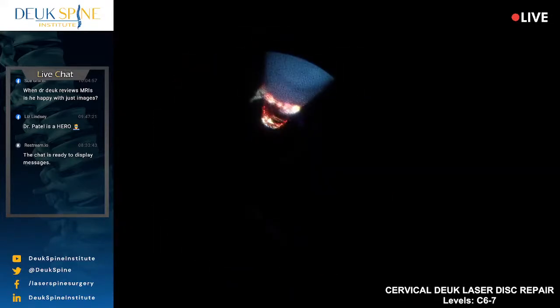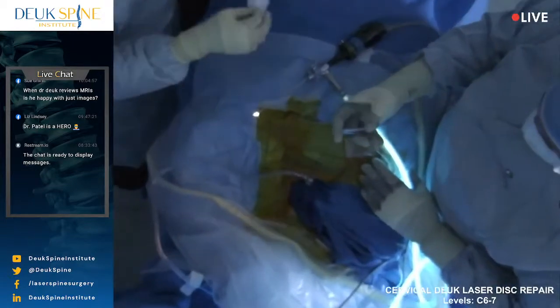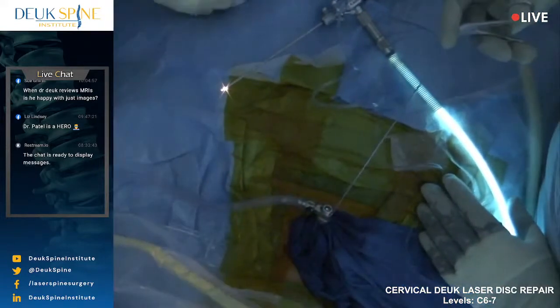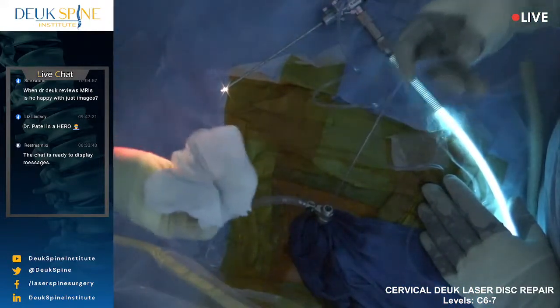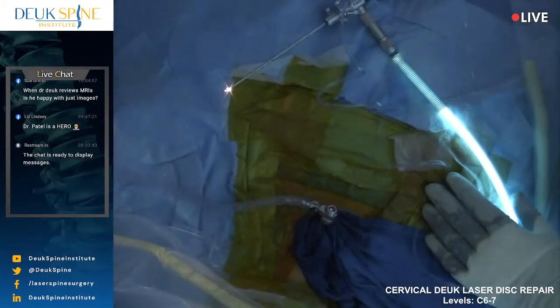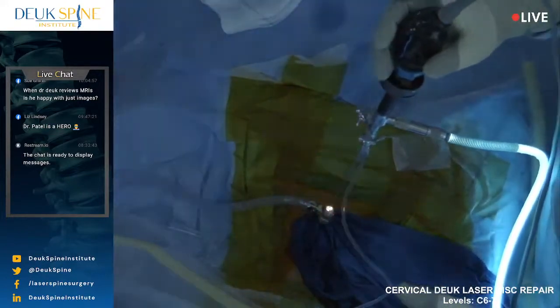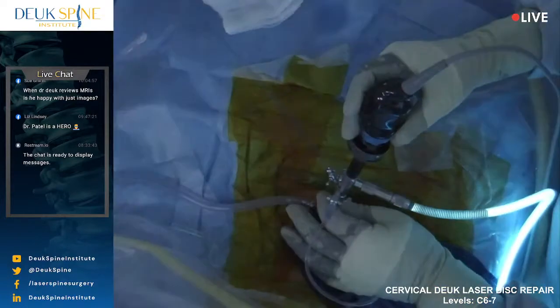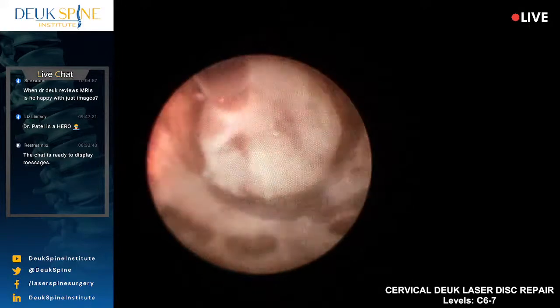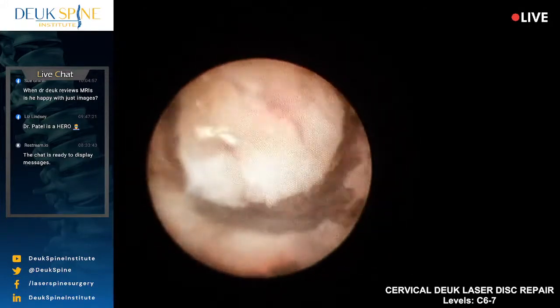Now remember, we don't have the blue stain today. Because I couldn't put the needle in first and then do the discogram, we don't have our blue dye. All right, get the irrigation on. So we can still do the surgery without doing the discogram, but this is all fragments of herniated disc.